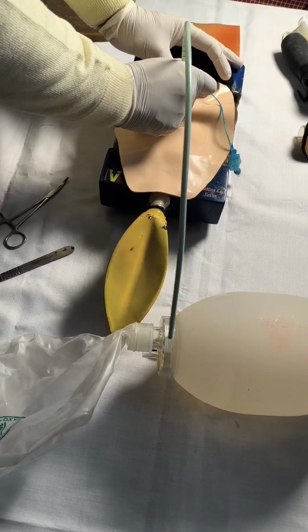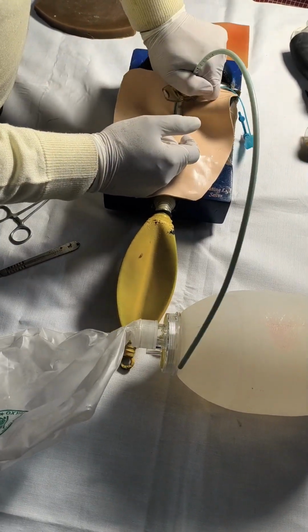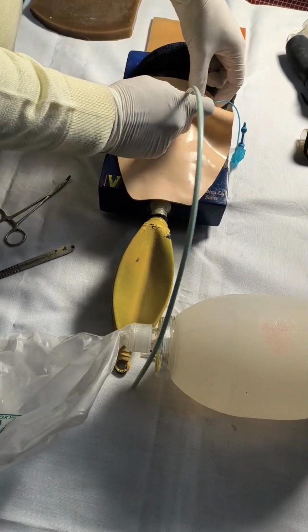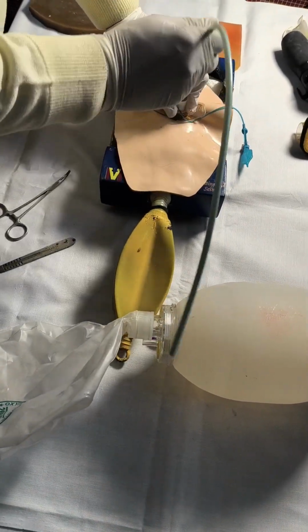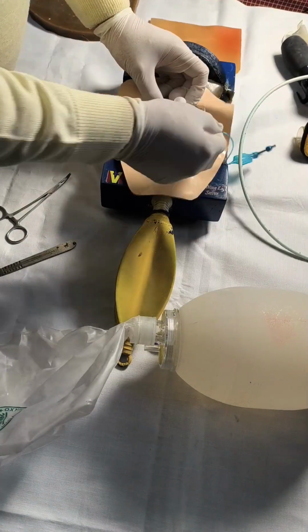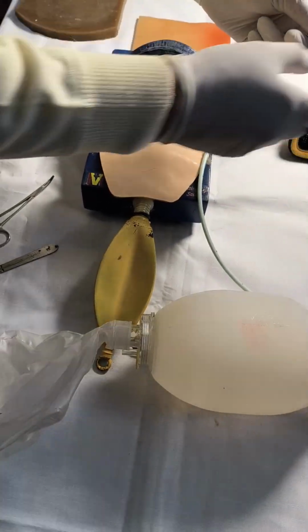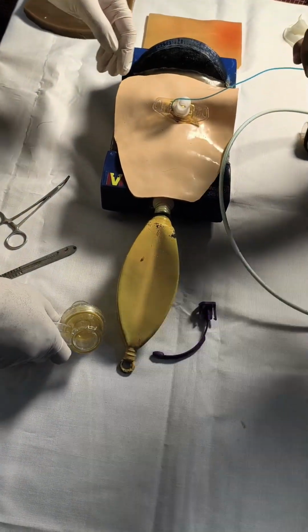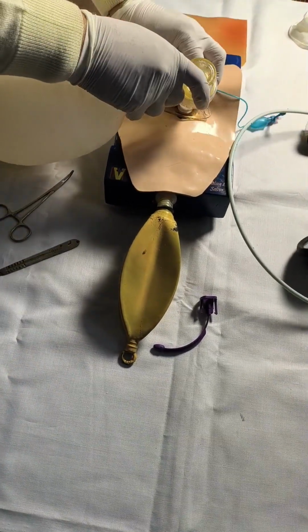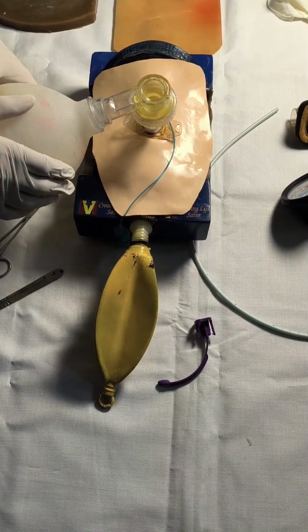Okay, so I'm stuck. I need some assistance. When we do a real Cric, there is some pressure required. Okay, now inflate the cuff, and now bagging, and now we are in the right place.